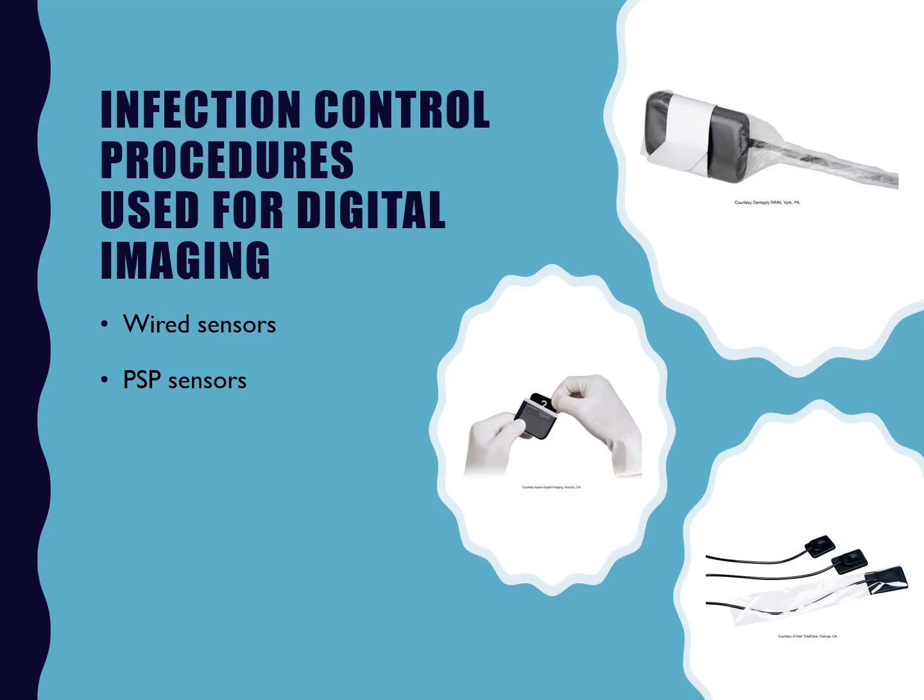Here we go. So this is where we're going to talk about how to prevent the spread of infection with our sensors. And these are just the digital ones. And so with digital, we have either wired sensors or we have those photostimulable plates. The PSP sensors are treated a little bit differently than wired sensors. And both of those are treated very differently than film.